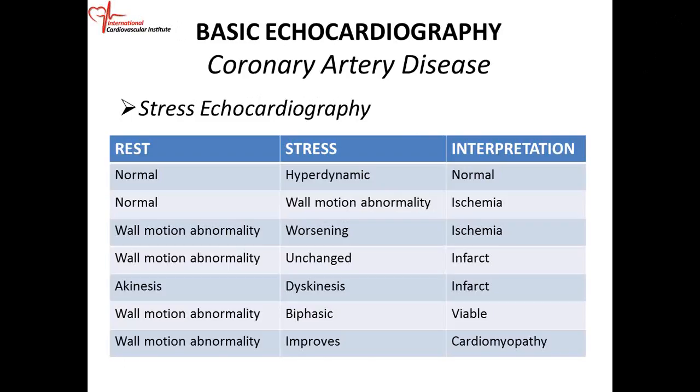So once you get a good treadmill test, and during the stress test, you're going to ask the patient, are you having any symptoms, chest pain? But don't just stop at chest pain, because patients' perception of pain can be tightness, pressure, burning, squeezing. So you need to go over all those things with them. Find out what type of discomfort they're having. Is the discomfort getting more severe as the exercise goes on?